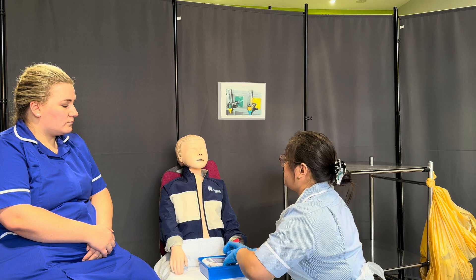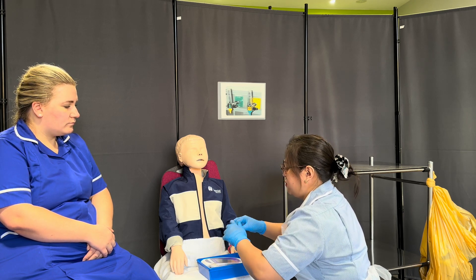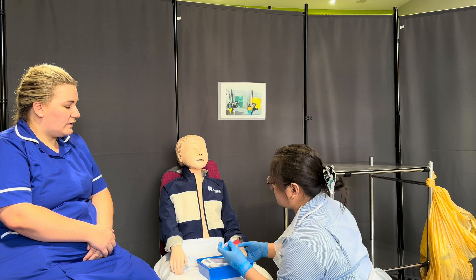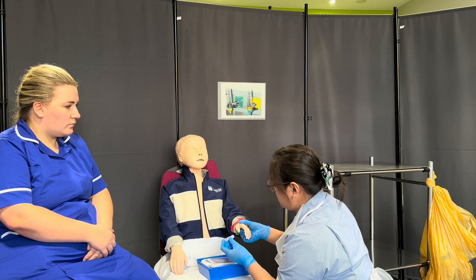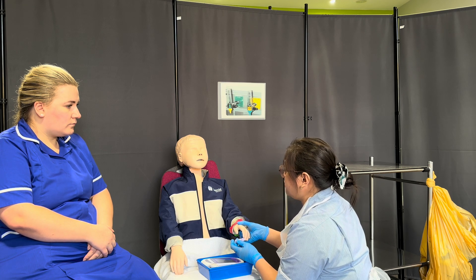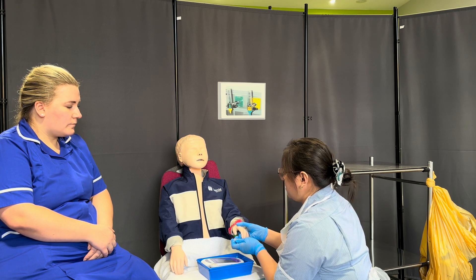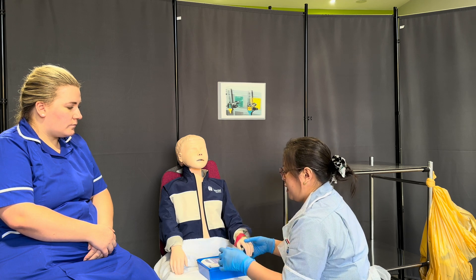So Mary, I'm going to prick your hand now — is that alright? I'm going to remove the safety pin. It's alright if I touch your hand. Okay, so I'm placing the lancet straight against the side of Mary's finger. And I'm going to count — four, three — after three, okay. I'll prick your finger: one, two, three — prick. And I'll discard the lancet right away.